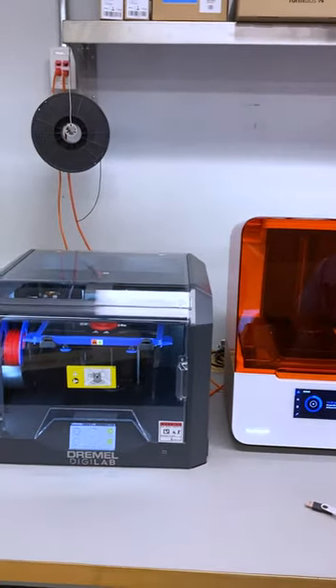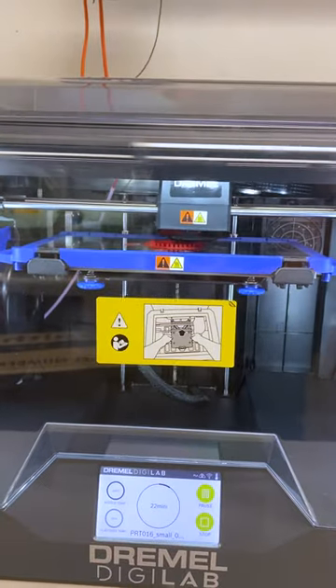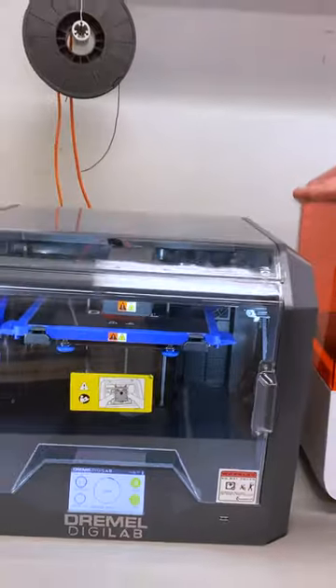Starting from the left side, this is an FDM printer. It uses a filament that gets fed in, heated, melted, and extruded. It builds parts layer by layer.